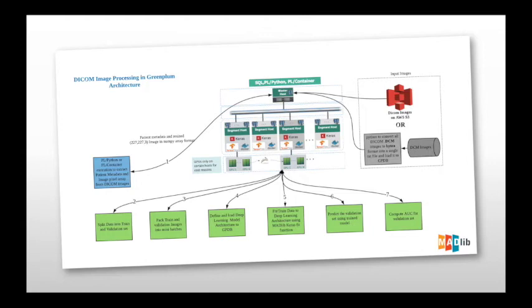Once you do that, it goes through iterations. We'll talk about the performance metrics of that. Once the model is trained, you take the trained model and score, or predict, on the validation set. The example data set we have taken is about 26,000 images, where each image indicates whether the patient has pneumonia or not. So it's a 1-0 classification.